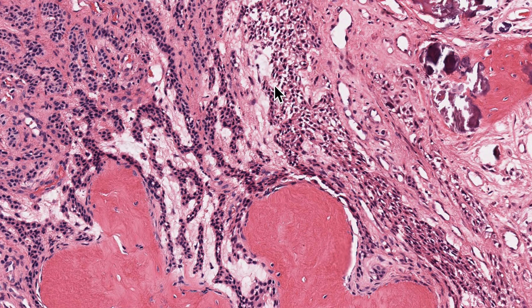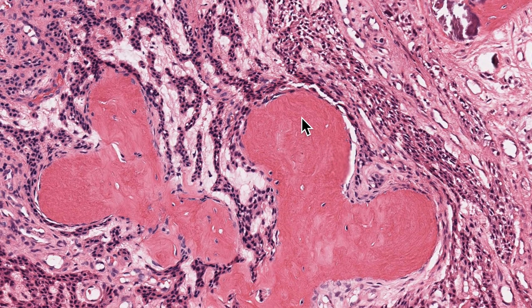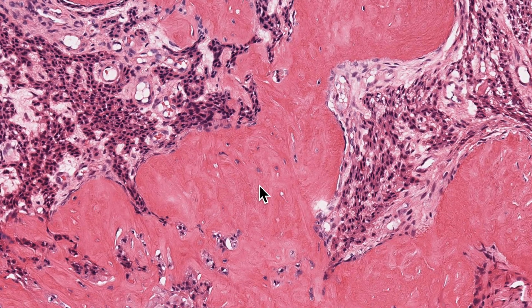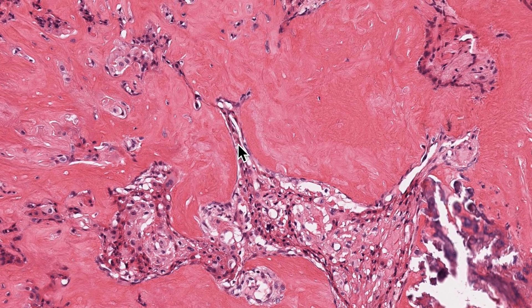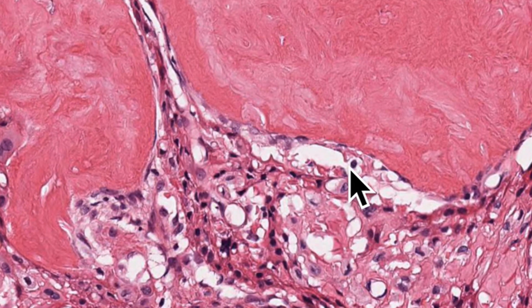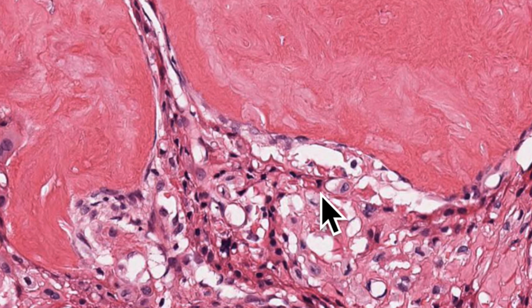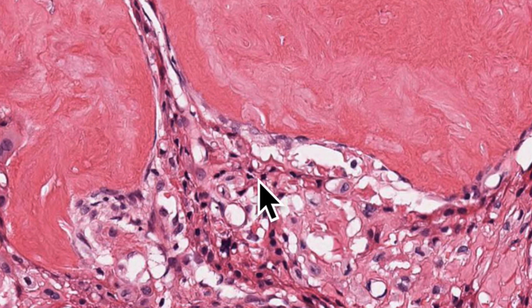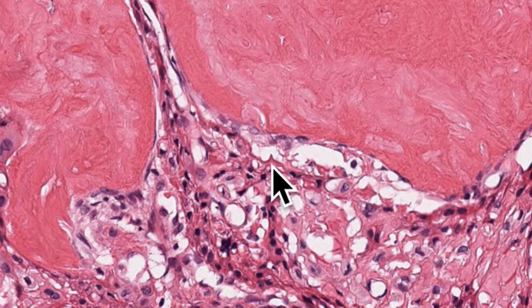One more important feature of CEOTs is the presence of intercellular junctions. If you clearly see in this area, the epithelial cells are beautifully showing the intercellular junctions between the cells — this is one of the most important characteristic features. Apart from their presence in sheets and being hyperchromatic, these cells show very prominent intercellular junctions.